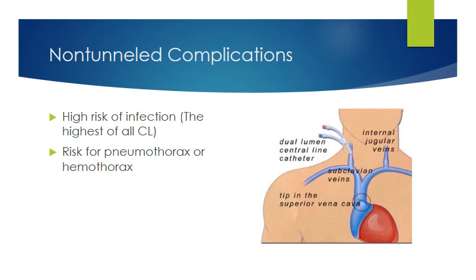Okay, so complications: they are at high risk for infection. And we already talked about this a little bit when we talked about the PICC. So why was the PICC at a lower risk? Due to the area that it's placed.